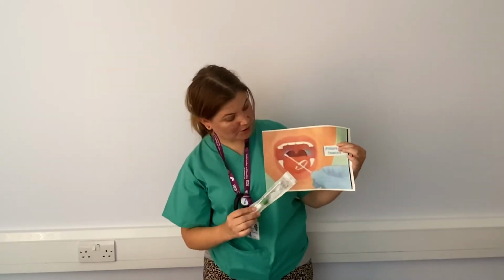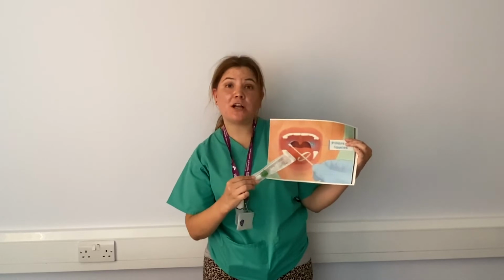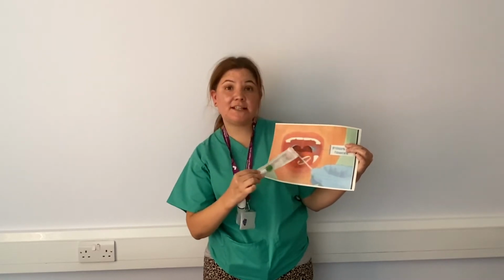When you're ready to take a sample, you will need a swab, which will come with a tube. The area that you will swab will be the back of the throat and the arch of the tonsils. That's a very sensitive area, and most people will feel a gag reflex. So I strongly recommend that you wear eye goggles or a face shield, since you will be close to the patient, within 1 meter, and at risk of respiratory droplets. This is very easy to do and it doesn't take very long.